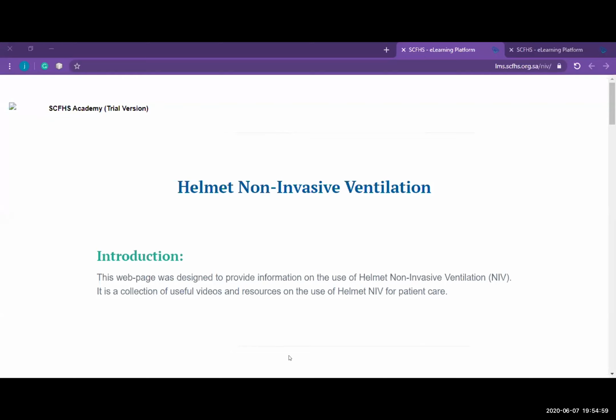I have a question regarding this, someone asking if it's possible to use it with the portable vent. He gave an example about the Oxylog. Now, if the Oxylog can provide non-invasive mode with pressure support, I don't think it will be comfortable for the patient, because you cannot do that much monitoring with the Oxylog.